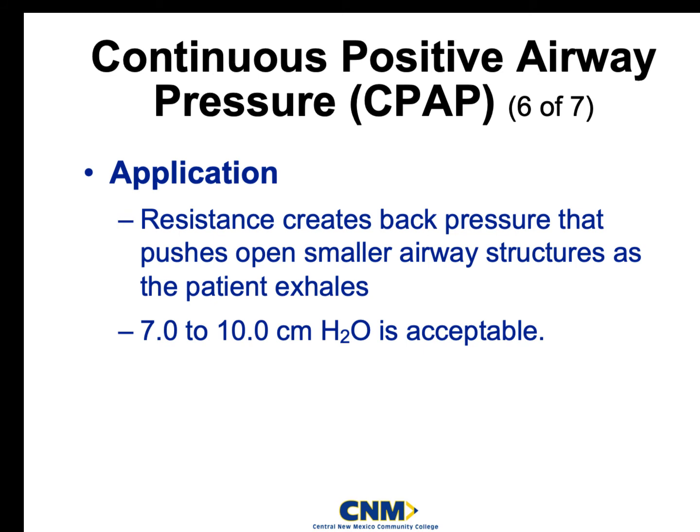There have been a couple instances where I've gone up to 20, but those were very sick people. But we usually stop right at 10, and we stop you at 10 because you are not able to start IVs. At the basic level at this time, you have no way to do fluid replenishment for your patients.